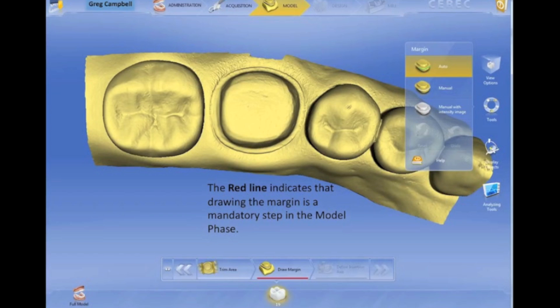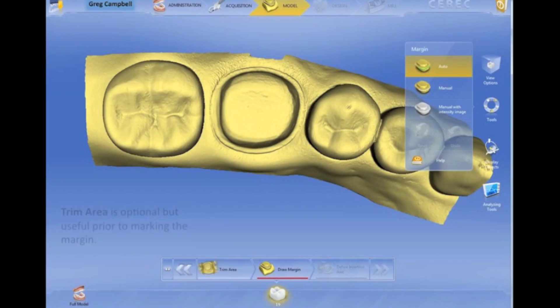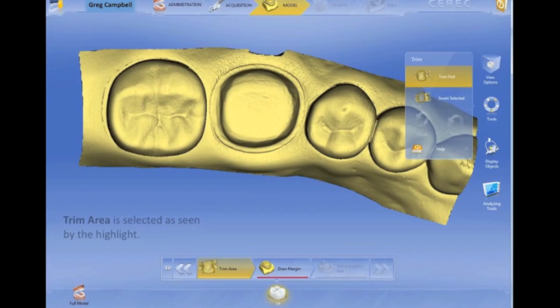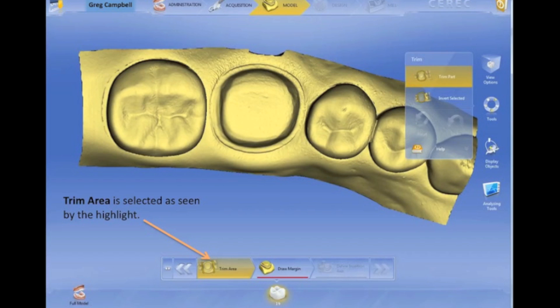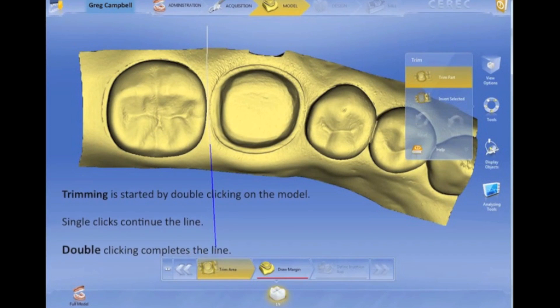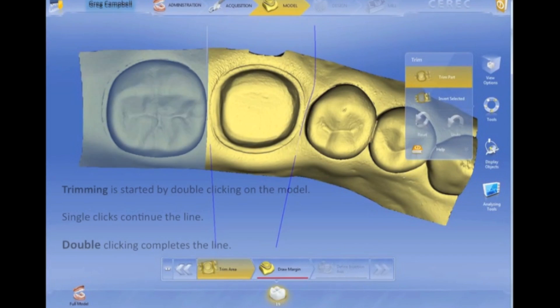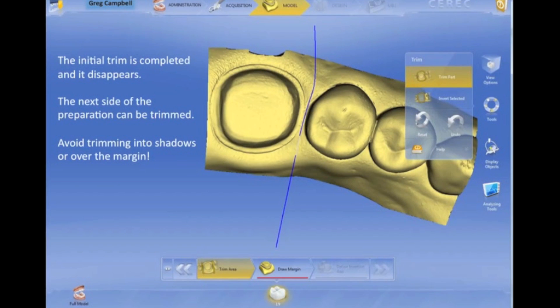A red line at the very bottom in your step bar is going to indicate a mandatory step. Trimming is not mandatory, but we're going to show you how to do it here. I don't really trim too many models, to be honest, but I think it's important to know how to do it. It's just like margining — double click to start, single click to tack, double click to complete the line, which will remove part of the model. You can slow this video down and just read along as we go.